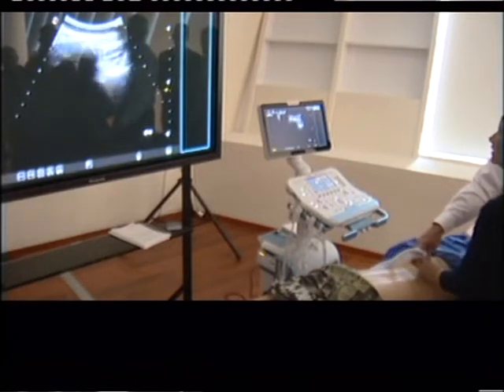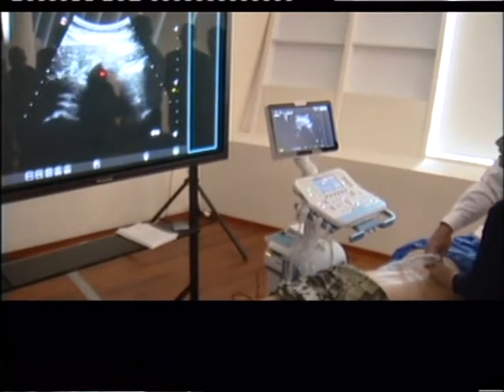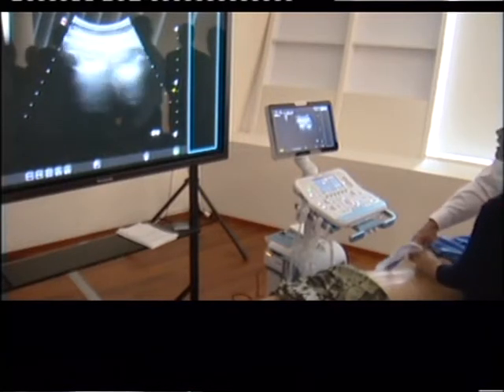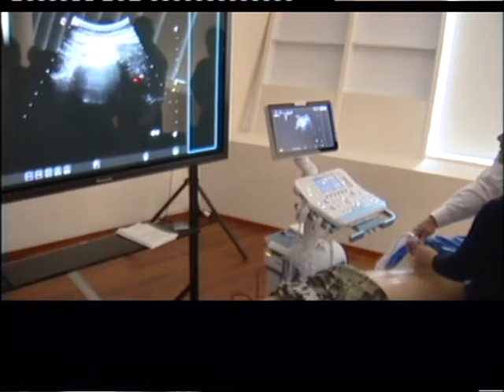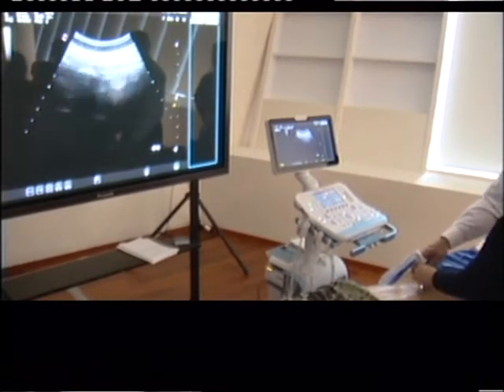Now if we go here, watch the ilium drop away. Go down, down, down, down, down, then joint. And if we go here, down, down, down, down, down, joint. And now, no ilium, no joint. Right there. And we go long axis.